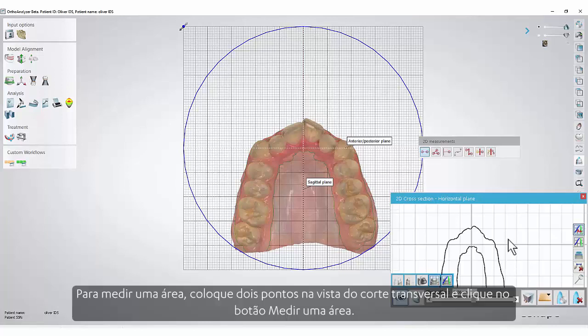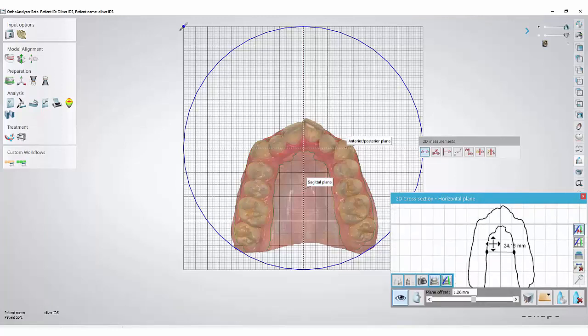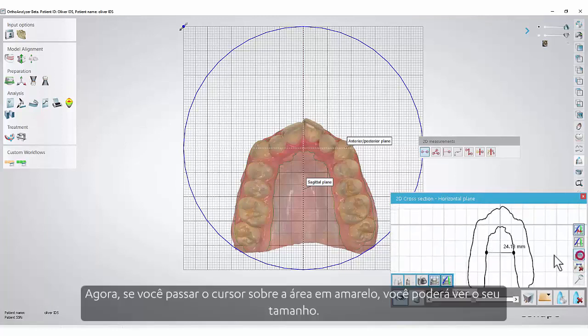In order to measure an area, put two points on the cross-section view and click the Measure an Area button. Now, if you hover the cursor over the yellow area, you will be able to see the size of it.